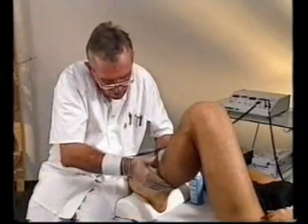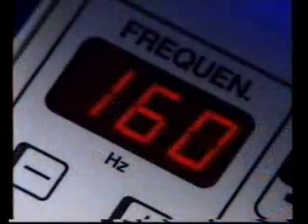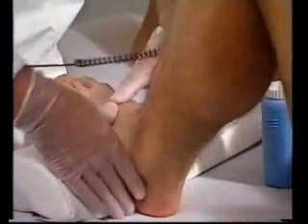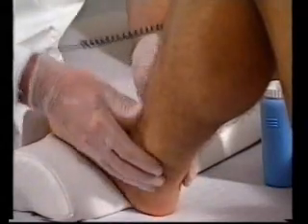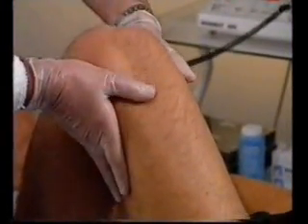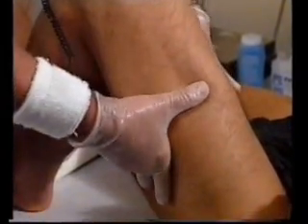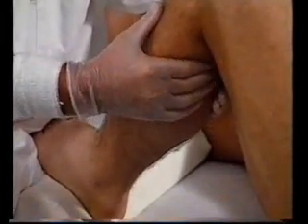In sports injuries, such as this rupture of a ligament, the Hivamat 200 is also employed with great success. The deep penetrating resonant vibration improves the local circulation, which enhances the edema resorption, the reduction in tissue pressure, and the disintegration of indurations of the connective tissue. Deep oscillation by the Hivamat 200 allows faster mobilization and freedom from pain, with subsequent shortened period for recovery.